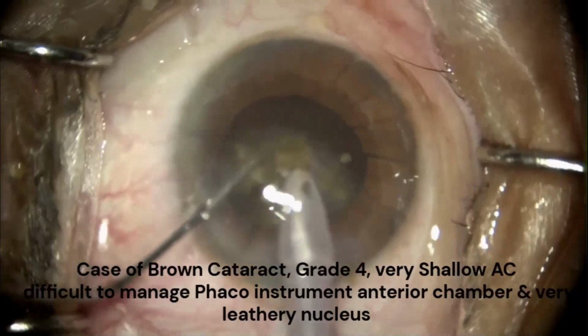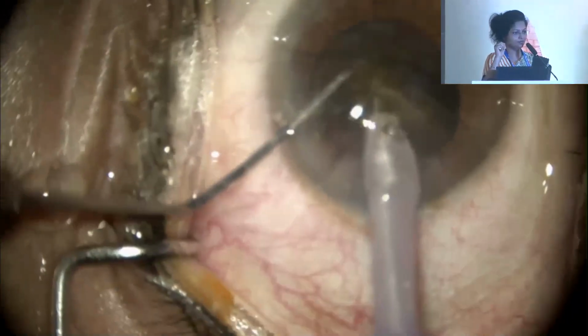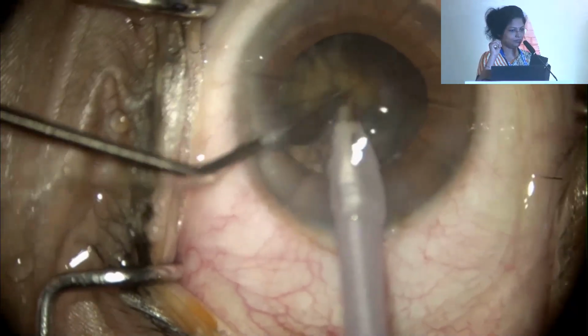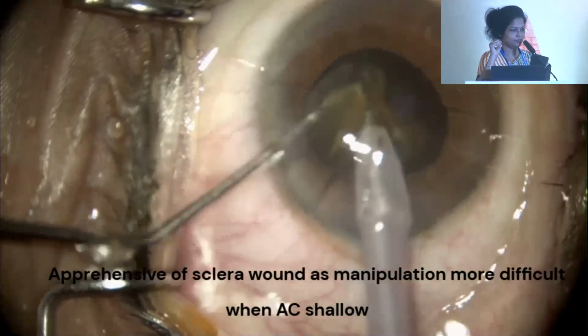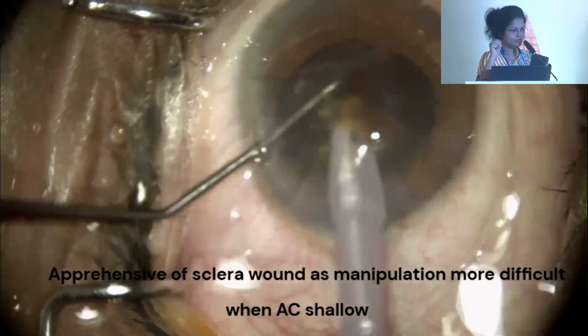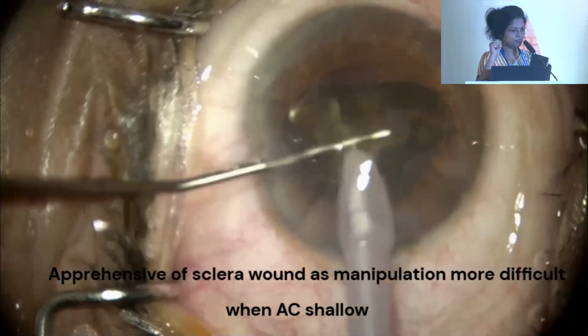Can you play the video? You can see the division of the posterior part of the nucleus is very difficult in this scenario. Though I could have done a scleral wound, I was really apprehensive in this case because the manipulation will be even more difficult with a scleral wound and a very shallow chamber.